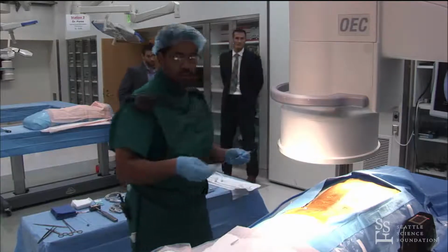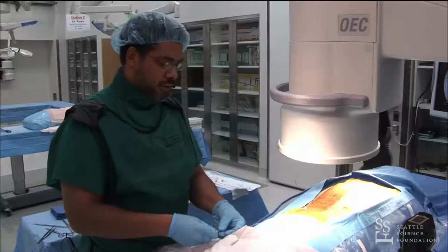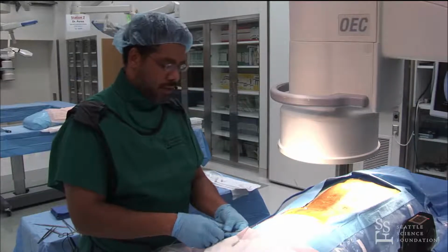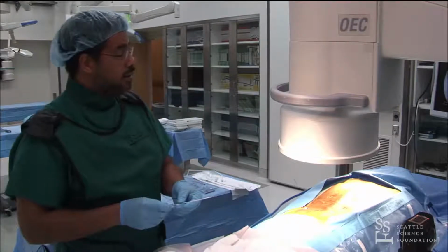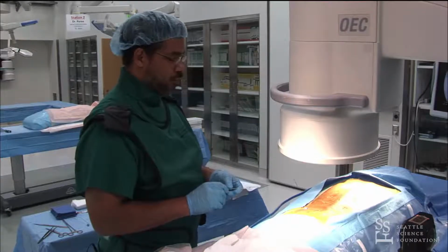Okay. So our first plan is to get our lead and sheath in position. I've never quite done it this way, but I'm going to give it a try today to see if it works, just so people get some perspective.